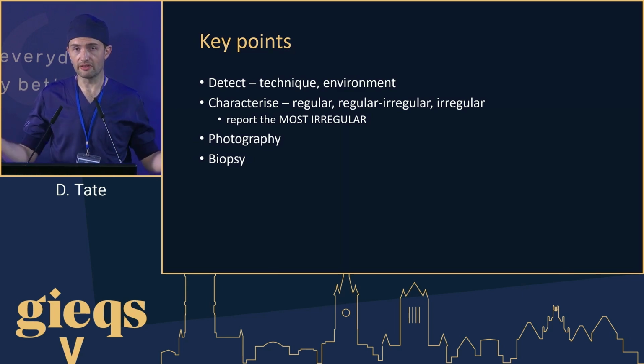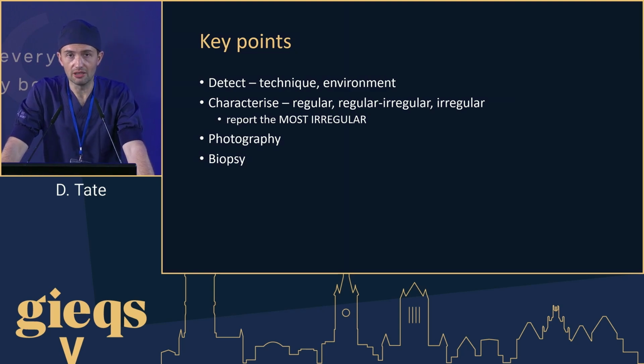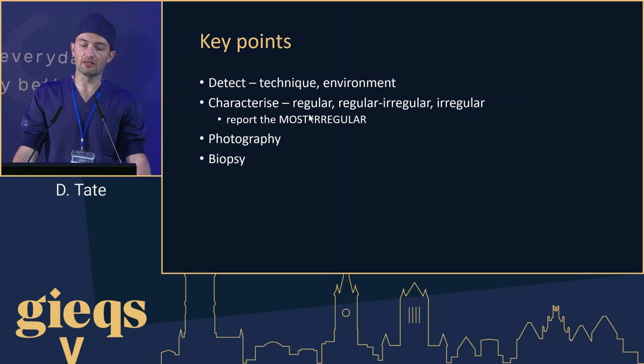And this is a very nice conversation that was had earlier in the live session about what actually are we striving to achieve. And of course, the great point was made that if there is something abnormal or you expect something abnormal, you should strive for excellence. And we can get there. We can get there with the latest generation of endoscopic imaging and with the right degree of patient sedation.